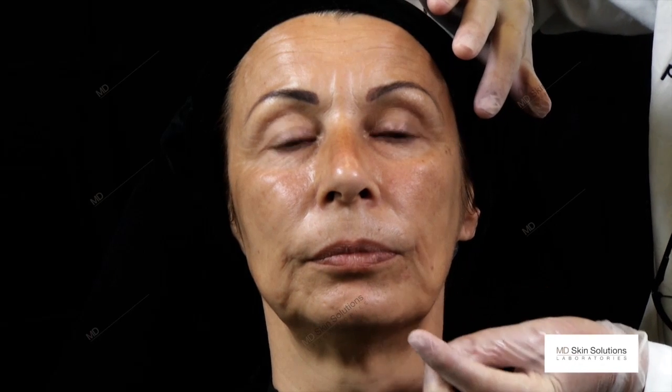And we will try to equilibrate, strengthen and redefine the jawline, certainly in the lateral part at the mandible angle up to the jowl.